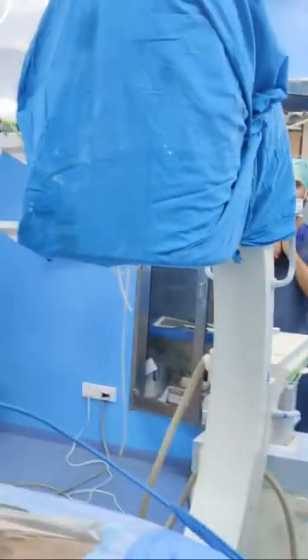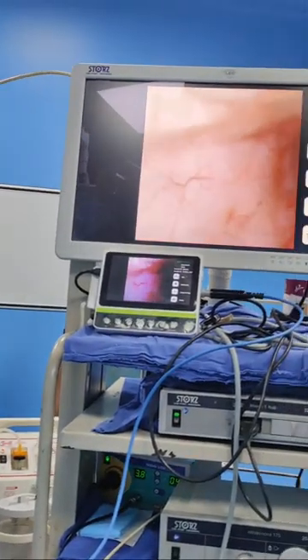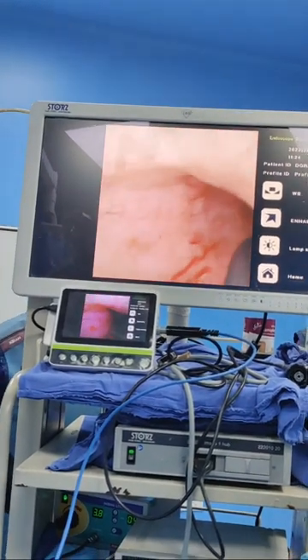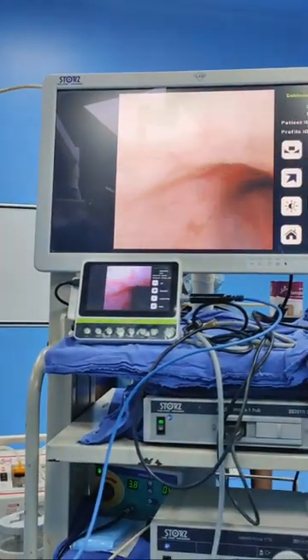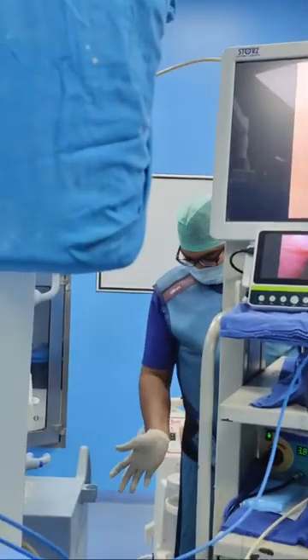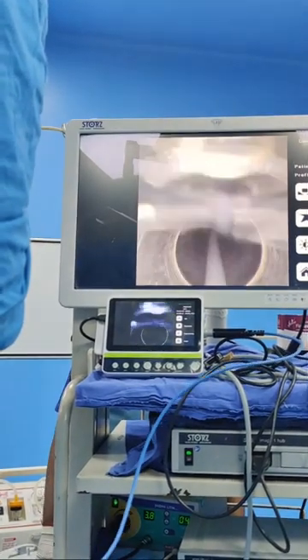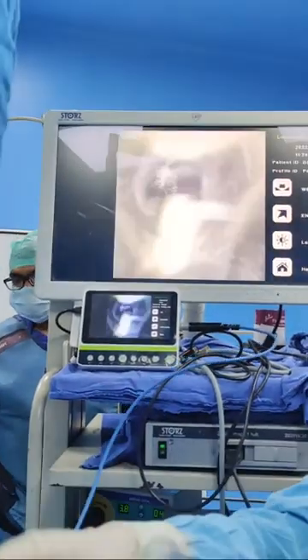How do you decide whether you want to put a double stent, nephrostomy, or both? So if you see here, it is a cooperative patient, so we put a stent so that we can take out the nephrostomy, that is very good. If you put a stent and you have to do a RIRS, it's very easy for residual stone because it's been dilated, there are few stones here and there, you can always pick up. So as a second step procedure in terms of RIRS, it's far easier to do. Second, if there is damage to the ureter, or an impacted ureteric stone, then yes, it is required.